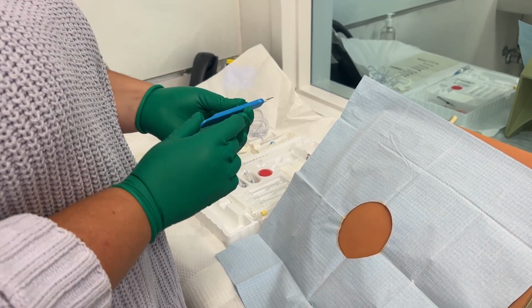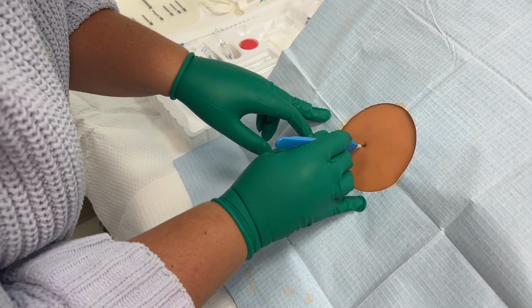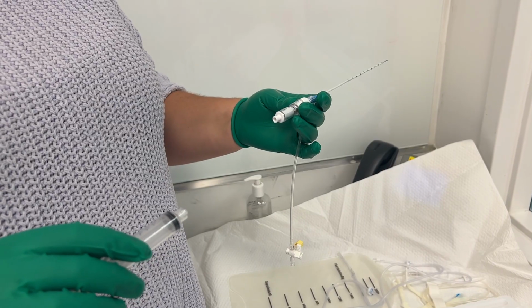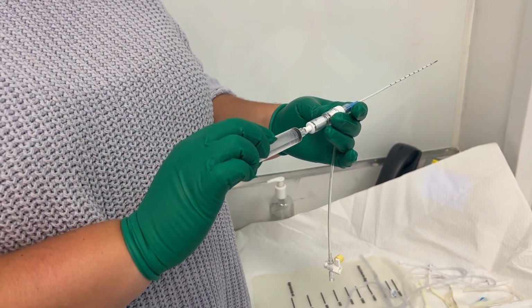Next, we'll take the scalpel included in the kit, find the area that we marked with the syringe previously using the ultrasound, and make a small stab incision just large enough for the catheter. In order to perform a diagnostic paracentesis, you will insert the needle into the catheter and then attach the syringe.